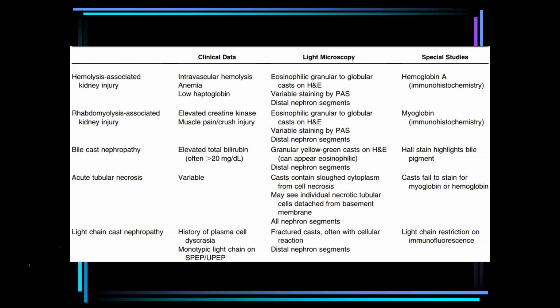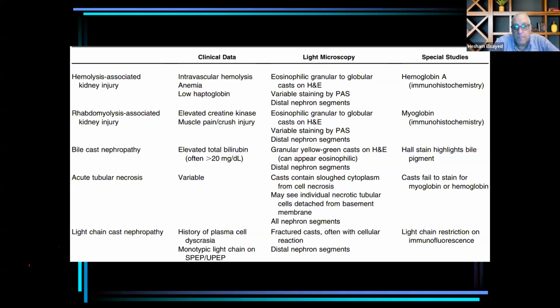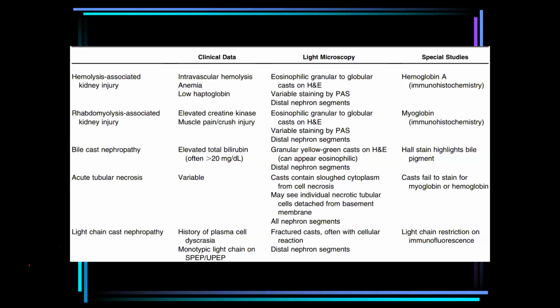I would like to emphasize something, Dr. Hisham. We have to differentiate between the urinary casts, the urinary finding, and what I am speaking about now, intratubular casts in pathology. These conditions are different. In a patient who has, for example, myoglobin or hemoglobin casts, it is not necessarily the case that we find a similar finding in the urine to what is present in the pathology. These are two different issues, so don't mix between these conditions.